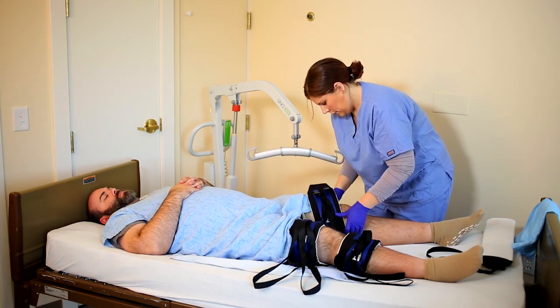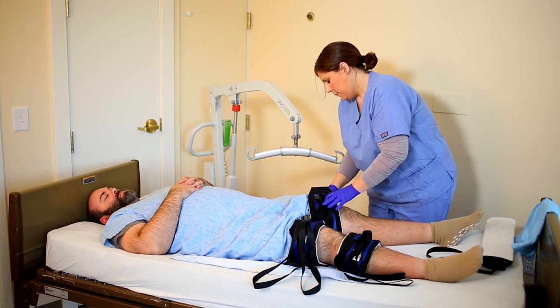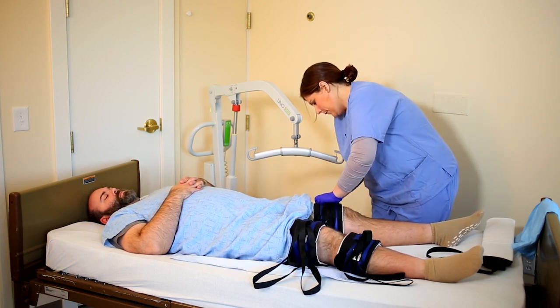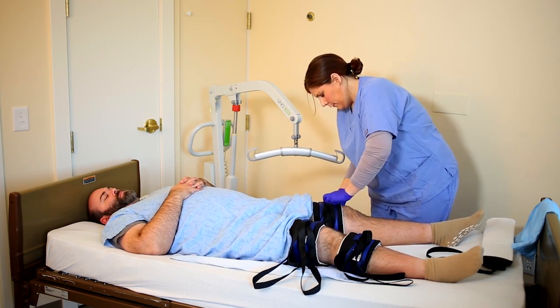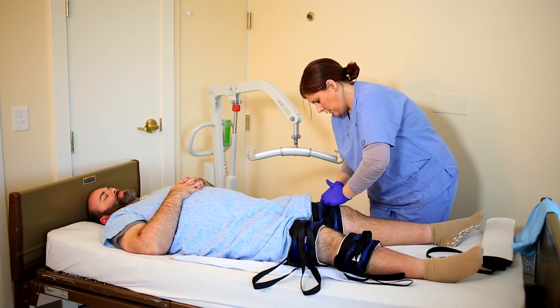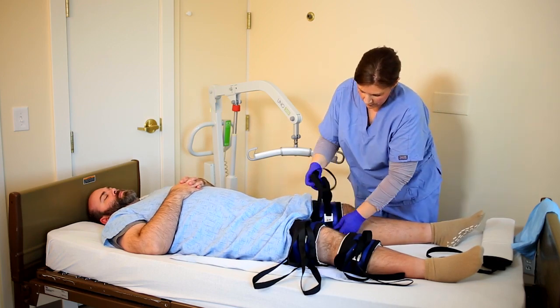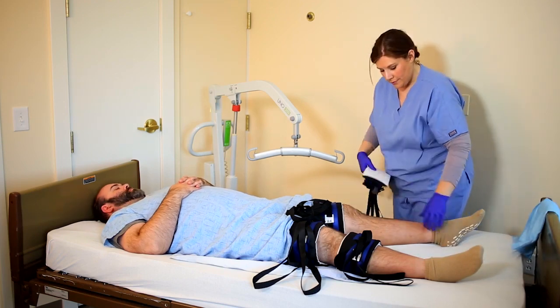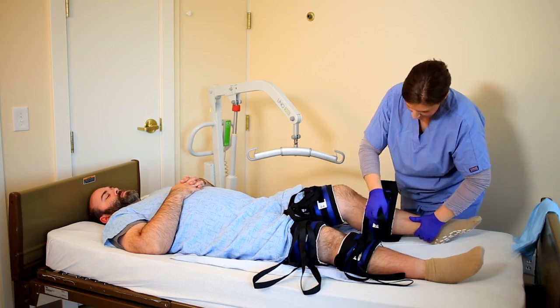In this case, we will be using our straps with Velcro fasteners. The Lavin Lift Strap comes in various sizes in order to ensure a secure fit. The secure fit around the leg is necessary in order to avoid slippage when lifting the patient. The straps will be fastened with the loops positioned face up. As in the basic process, our demonstration is being done in real time.